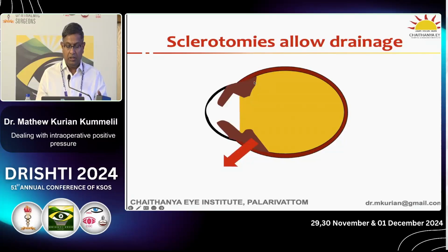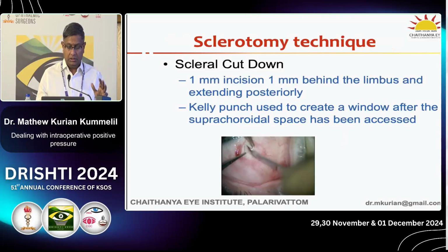What will happen is ciliary body area blood collection rotates the ciliary body, AC becomes shallow, and glow will continue to be good because it is not gone up till here, because you are operating in a closed environment. Okay, so sclerotomy is what I would suggest.